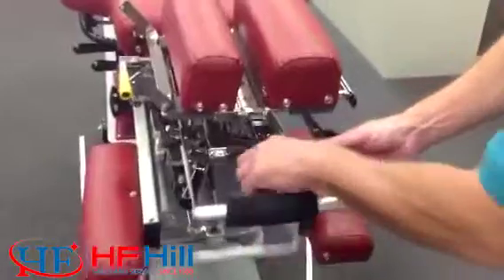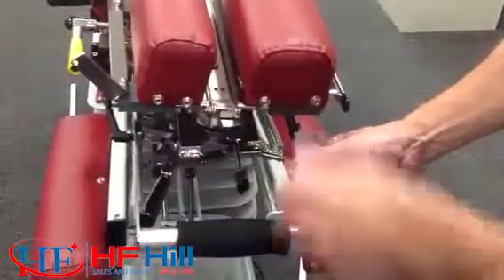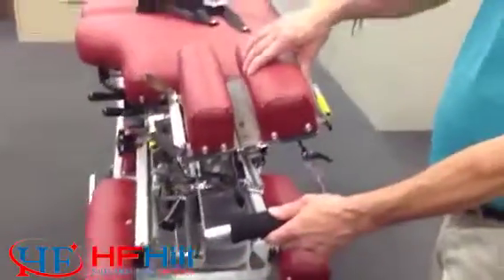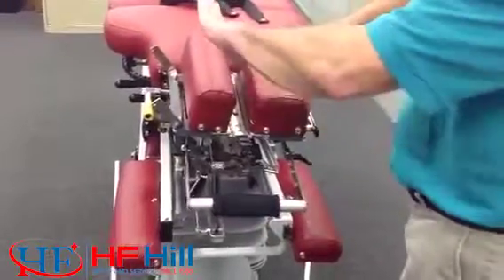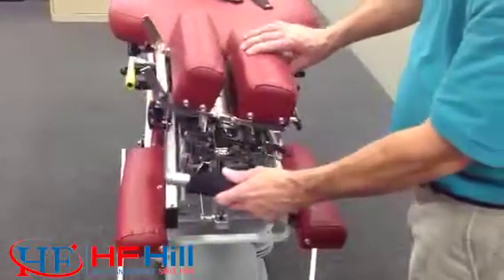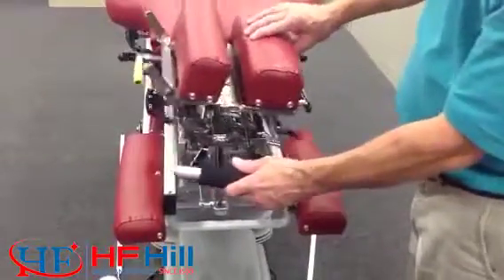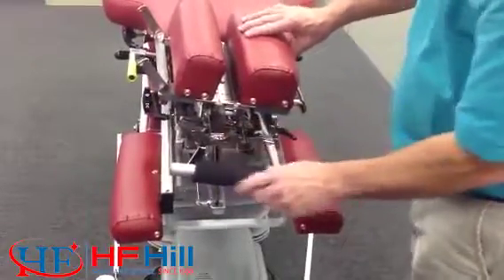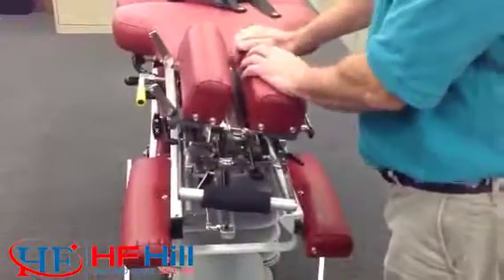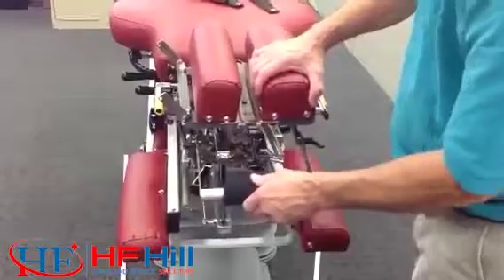We have this knob here, and it's another spring-loaded knob where you pull and you turn. So when you turn the knob, it locks in the out position so that we're open, and in this position here, notice the rotation is around the axis of the cervical spine. It's a very unique sort of motion, and if you're dealing with any cervical scoliosis, it's an ideal rotation move. So we can lock it in a rotated, locked out position, and again, we can do drops in any one of those positions. So we're going to pull it back out and return it to the neutral position, and there you have that.